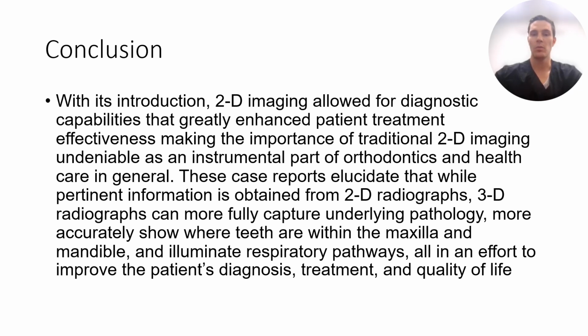This is essentially what we will be doing for all 6 patients. As I've shown you, we have 3 here in this research, and they will follow the same format for the other 3, each having a variable type of pathology, shown with a 2D lateral ceph and a 3D CBCT image cut.